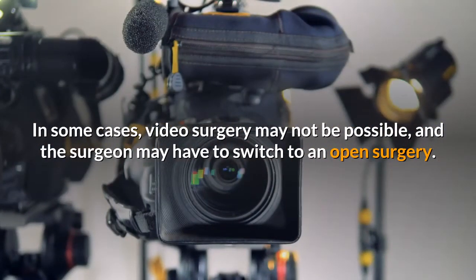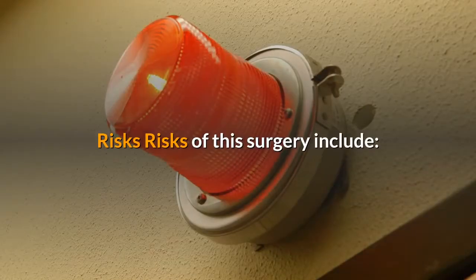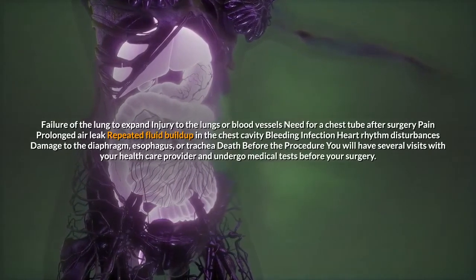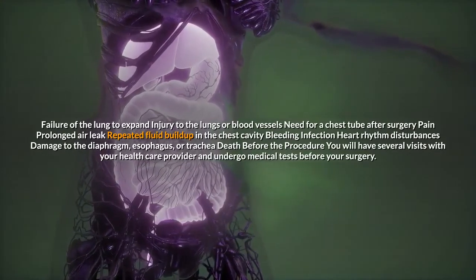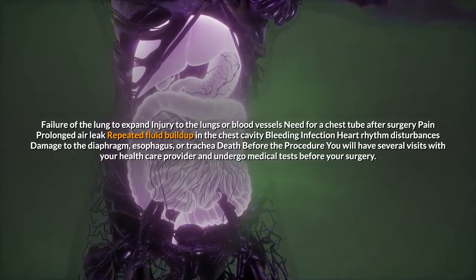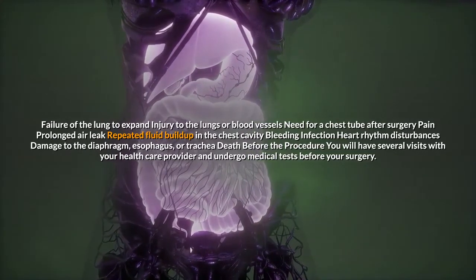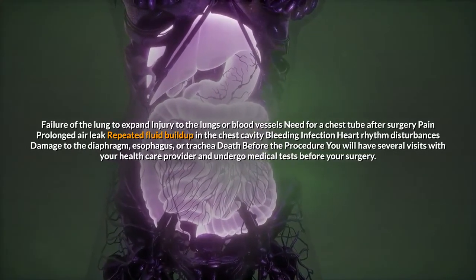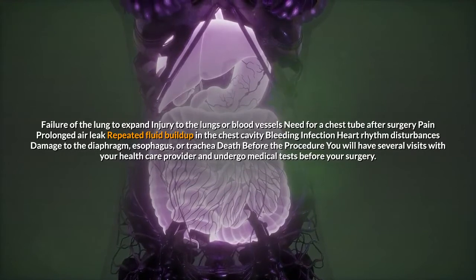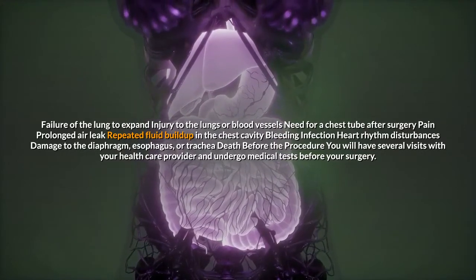Risks of this surgery include failure of the lung to expand, injury to the lungs or blood vessels, need for a chest tube after surgery, pain, prolonged air leak, repeated fluid buildup in the chest cavity, bleeding, infection, heart rhythm disturbances, damage to the diaphragm, esophagus, or trachea, and death.